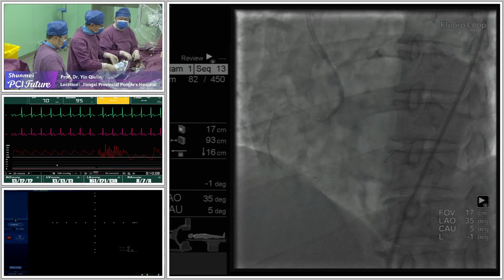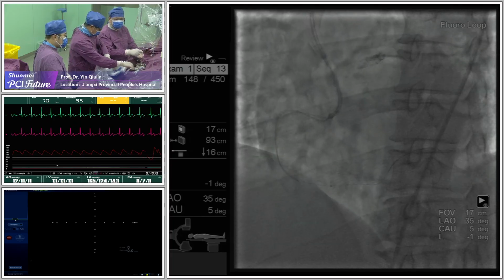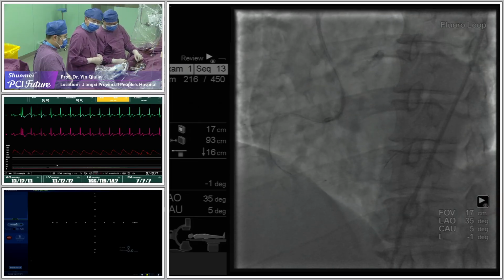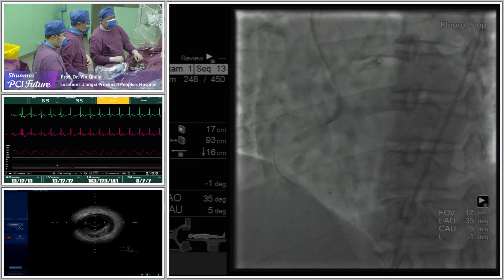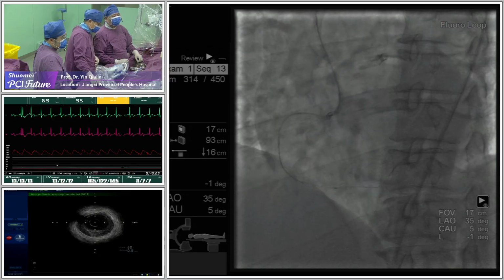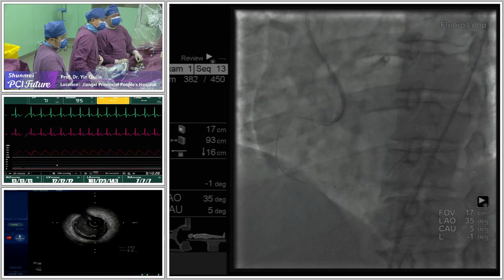For everyone in the room, this is where they think the proximal cap is. It makes sense, in all honesty. I'd love to see another projection, though. From the previous angio, we do not have antegrade flow in this one, so I think antegrade flow will be very interesting also.